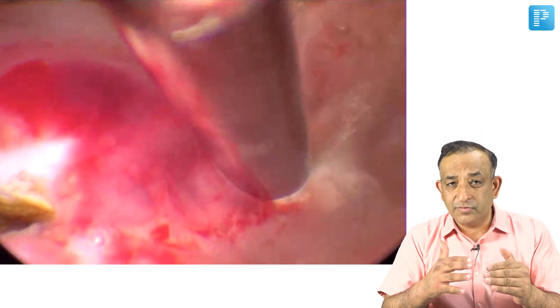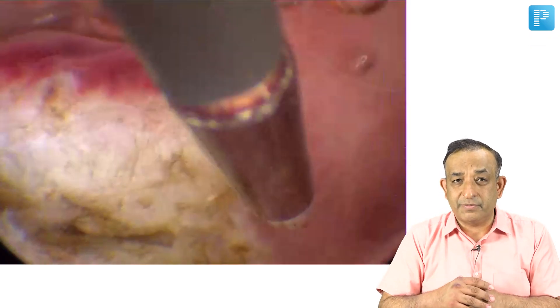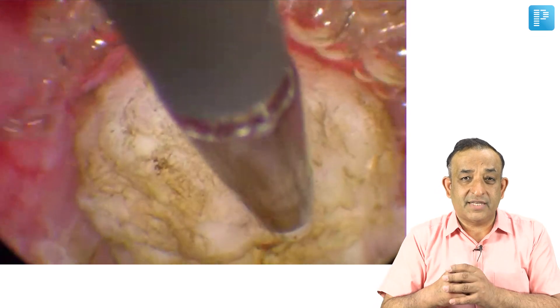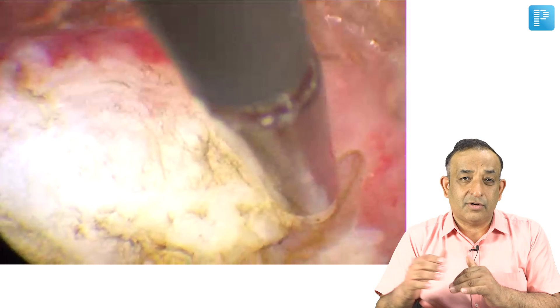With this instrument I am trying to remove the fibroid from the little bit of extension it has into the myometrium. I am also showing you the base of the fibroid — I am lifting the fibroid to show you — and this is how the fibroid is removed.